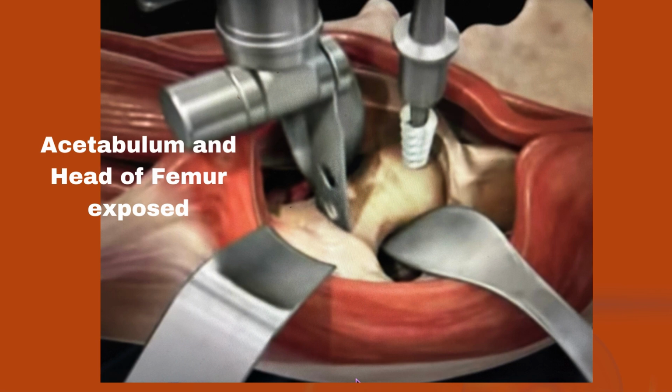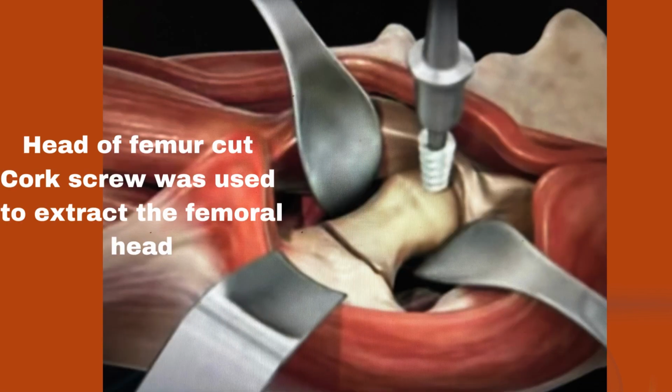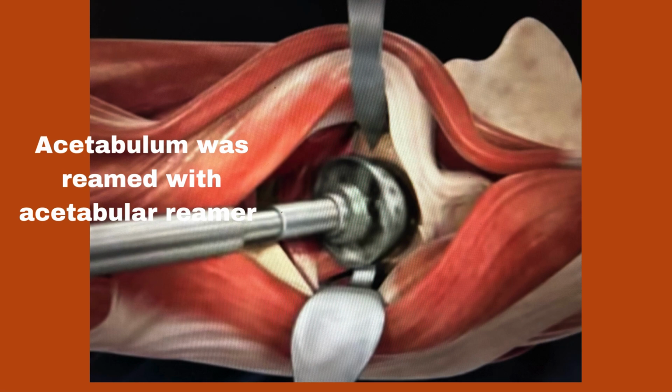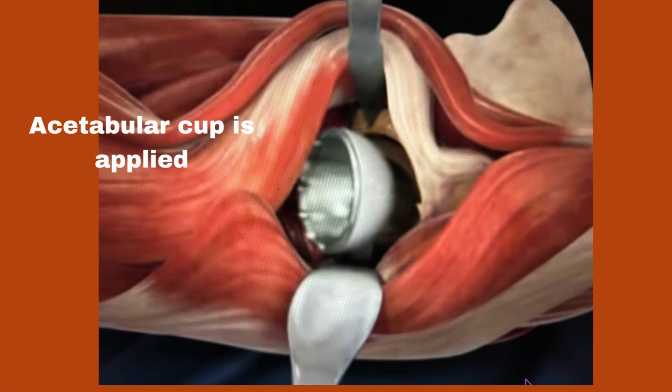The socket is called the acetabulum. The acetabulum will be exposed. Then the surgeon prepares the acetabulum for its acetabular cup prosthesis by using a special tool called a hemispheric acetabular reamer to grind down and shape the socket. The acetabular cup is placed into the reshaped socket.